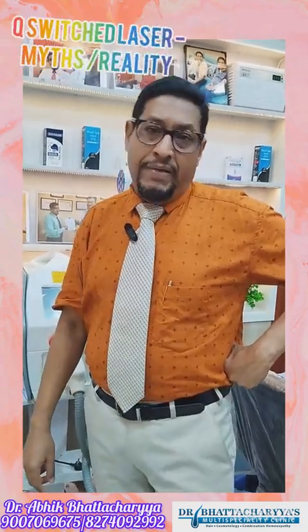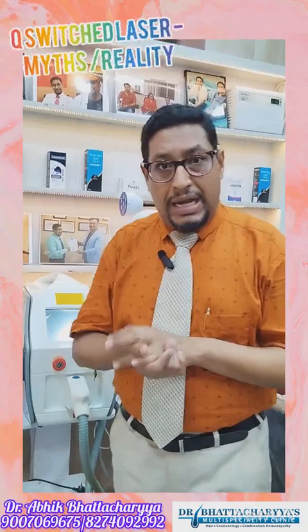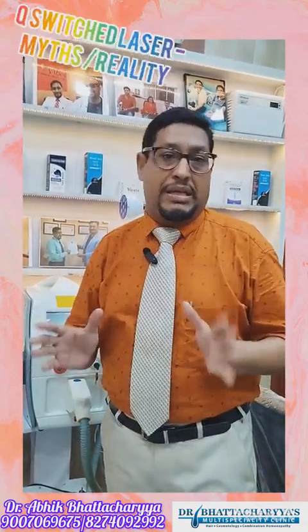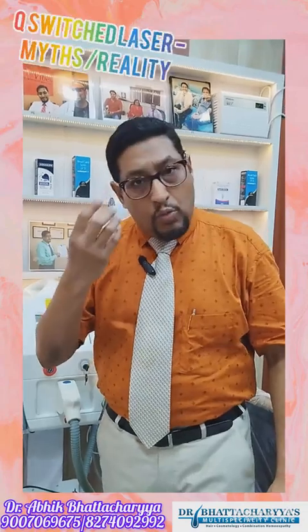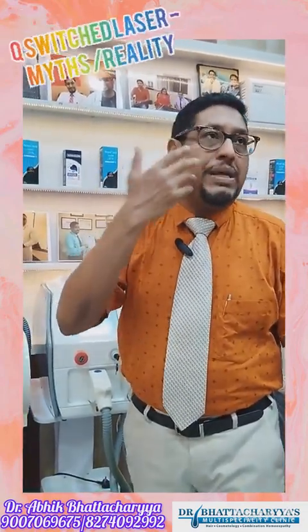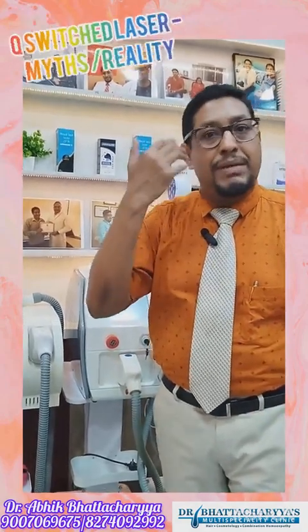These laser machines have two dangerous types of complications. One is hyperpigmentation and one is hypopigmentation, which you may not be aware of, and nobody will tell you during consultation. With hyperpigmentation, when we do the laser, if the fluence is not proper, it will increase the pigmentation. The tattoo pigment will increase, melasma becomes more brown, and freckles become more brown. With hypopigmentation, the area suddenly bleaches and becomes white, with no pigment throughout the portion.